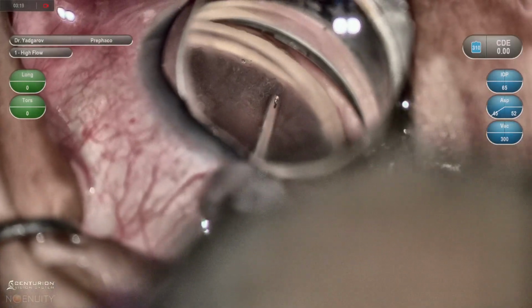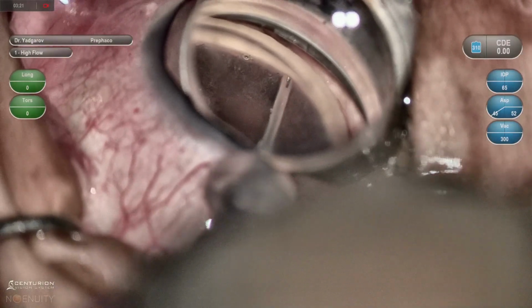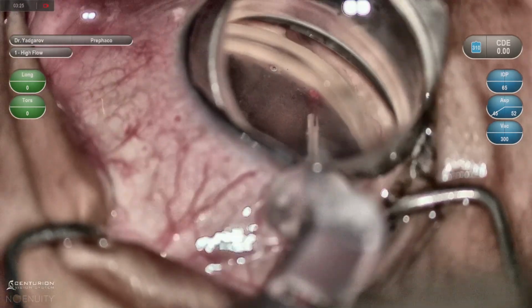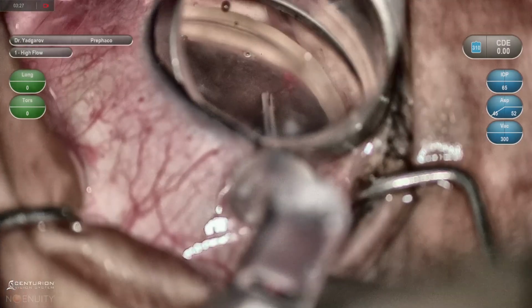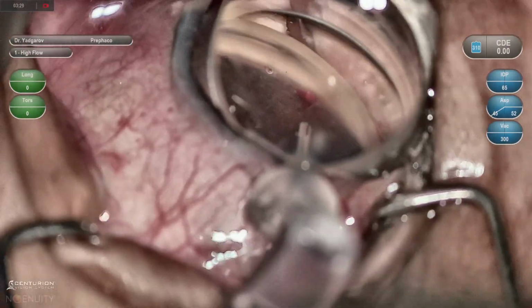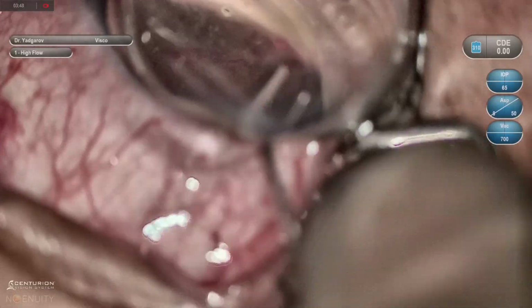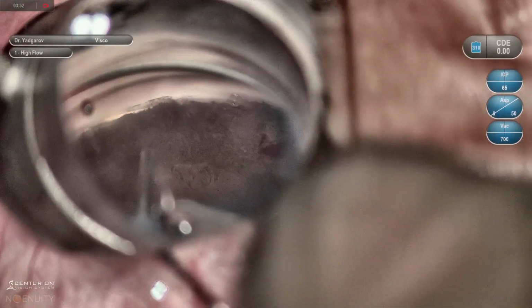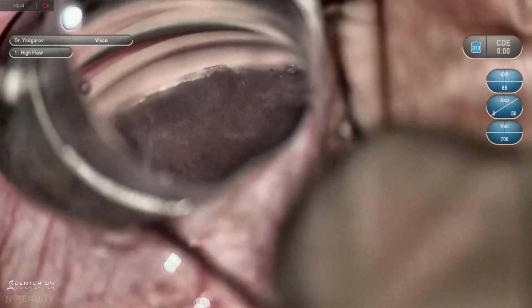With this last implantation, the I-stent actually does not leave the trocar. And what's nice is I have as many clicks as I need to get that I-stent into proper position. And here I'm just visualizing the three stents in good position next to an obstructed Hydrus.